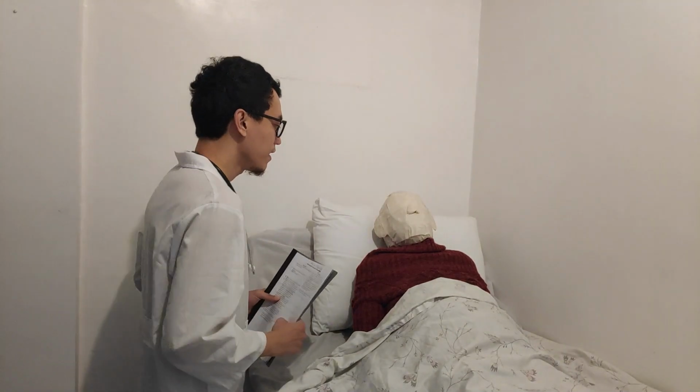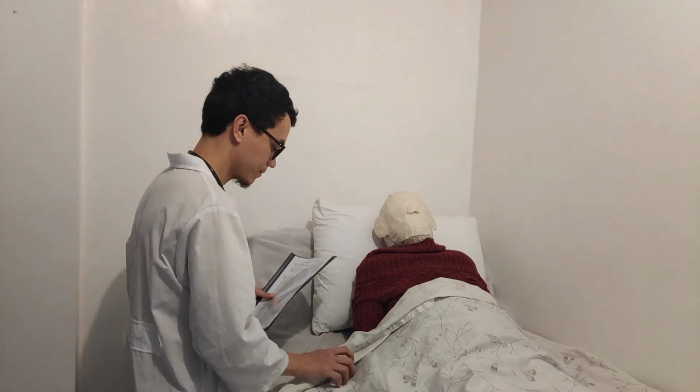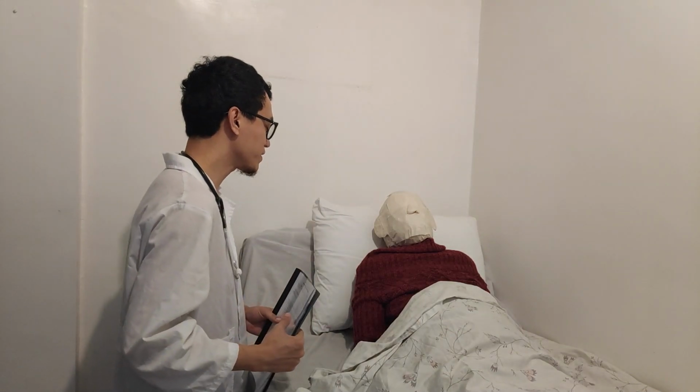Next is identify the patient. In identifying the patient, we have to use at least two identifiers, ask the patient's name and check the patient's name tag, and then compare these identifiers from the medication administration record to ensure that we are giving the medication to the right patient. Hi, good morning. May I know your name, please? Thank you so much, Mrs. Santos.